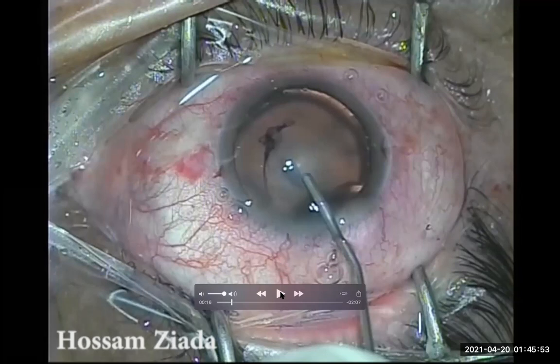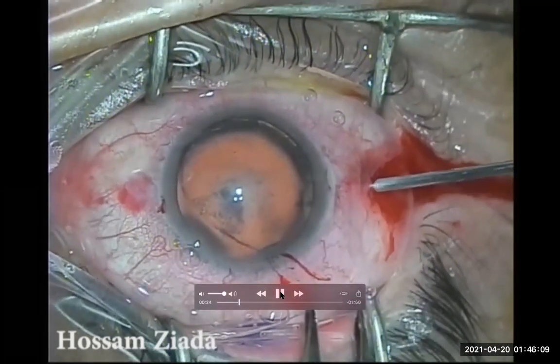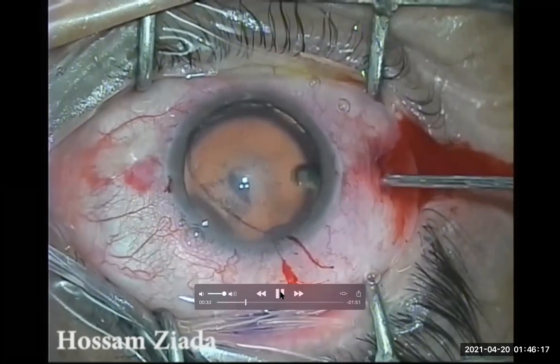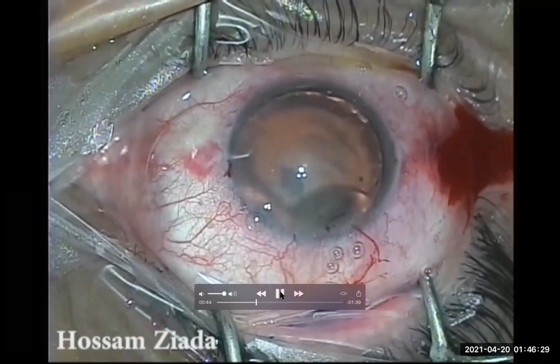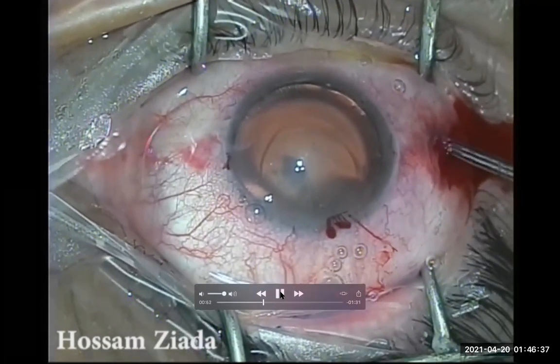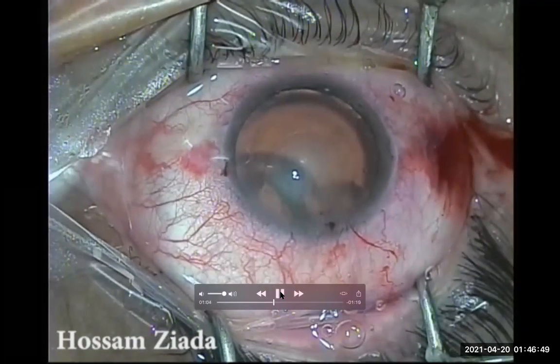The solution was analogous to the Mannitol approach — decreasing the vitreous volume — but this time directly, without medication, by performing a pars plana anterior vitrectomy. I made the pars plana incision using the MVR blade, measuring 4 mm from the cornea, being very careful to direct it downward and not touch the back of the lens. After removing just a small portion of the anterior vitreous, the intraocular pressure dropped dramatically — the cornea even started to collapse — and I now had a very good, deep anterior chamber to work with.